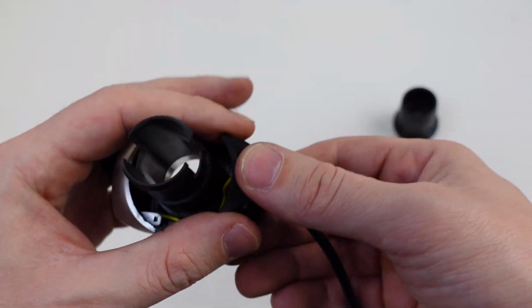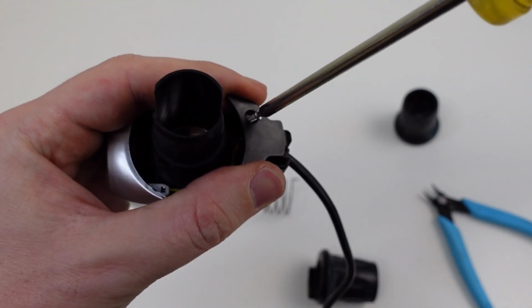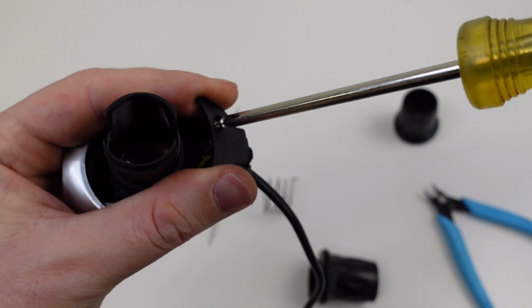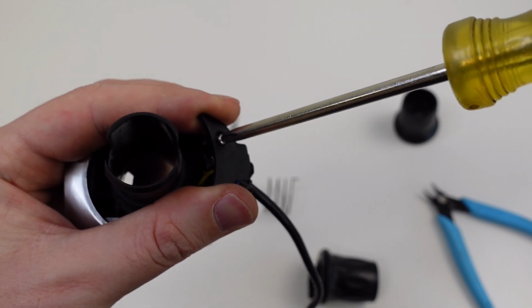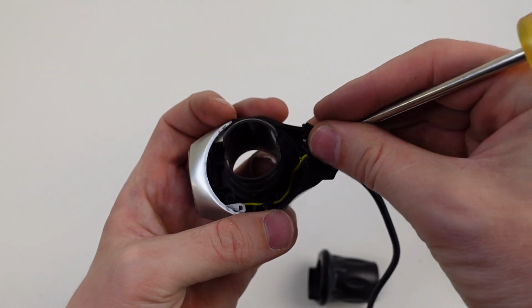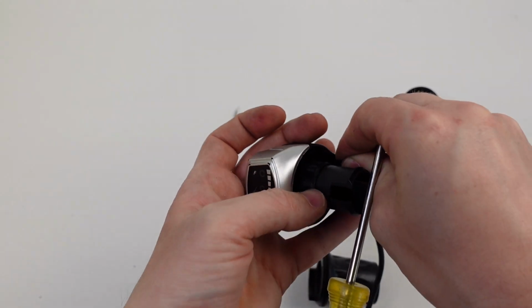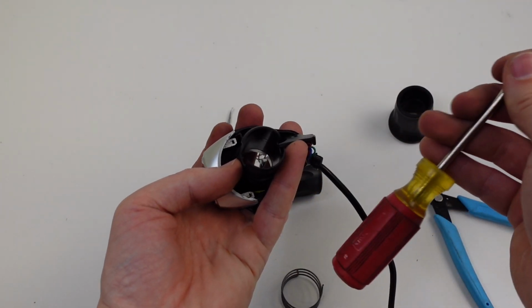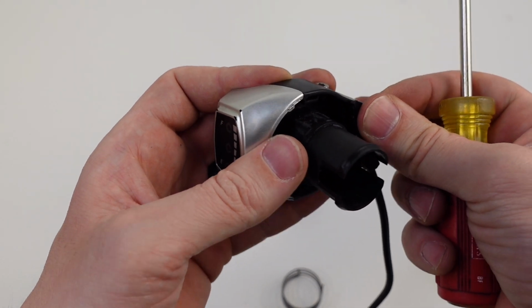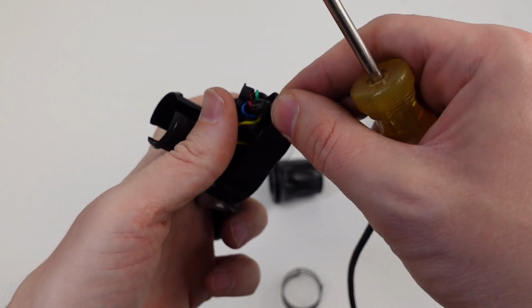Sometimes it's easier if you just go ahead and start it, because the screw won't go inside on its own. So get that started. And then from here, line it up, just like that. It's really difficult to do with the camera a few feet away from me, so. Alright, there we go.